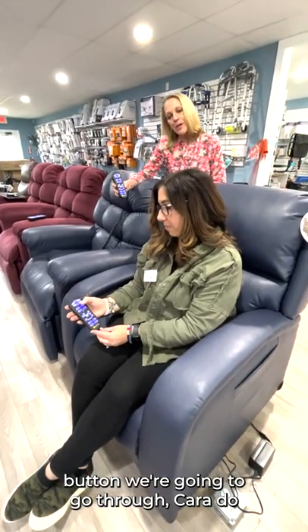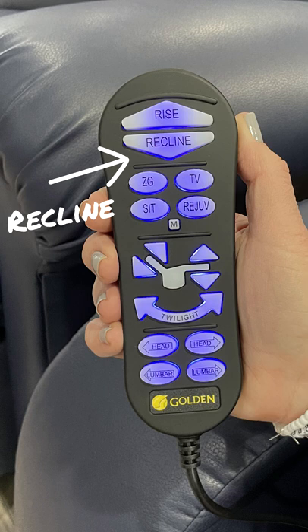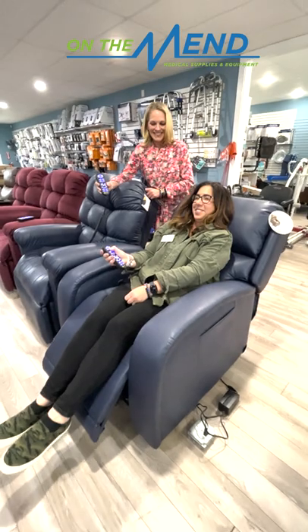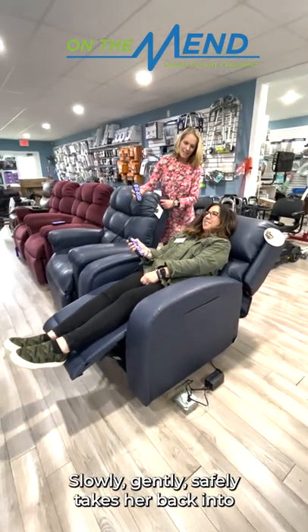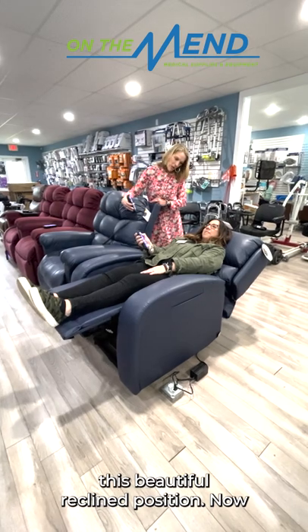The first button we're going to go through — Kara, do the pre-programmed recline. Slowly, gently, safely takes her back into this beautiful reclined position.